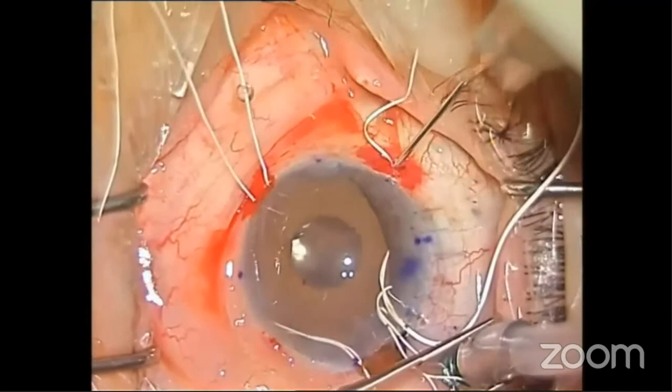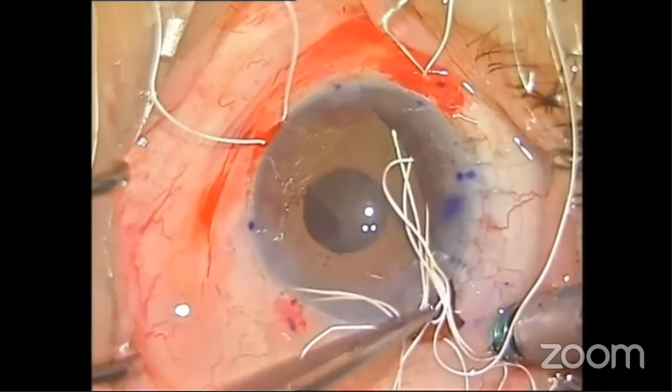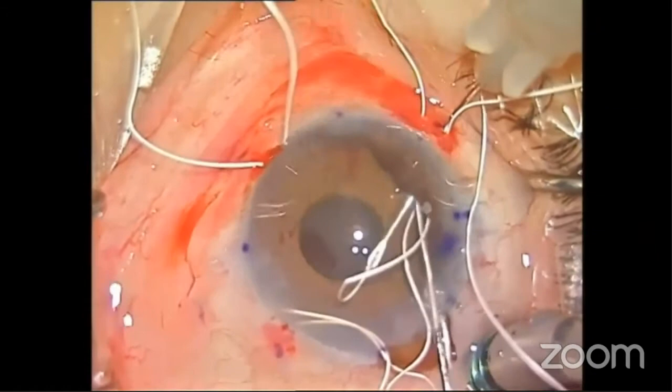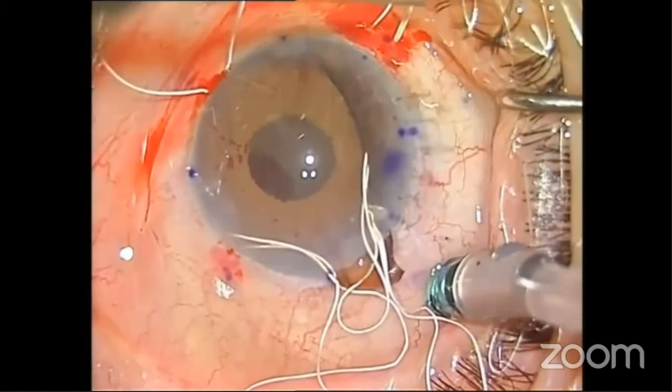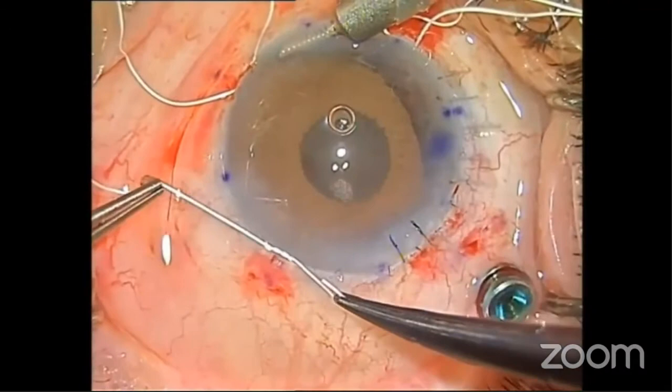When there's residual iris, you go under the iris like you would do with a capsular tension ring. We extend the suture loop to lasso the end of the suture to the artificial iris at that point, and then we retrieve both ends, and you can see bit by bit we are going to fixate this, anchoring it very strongly to the sclera. You can do 2-point fixation opposite the points where the haptics are fixated, but you can also do this at 4 points, and I prefer to do this generally.